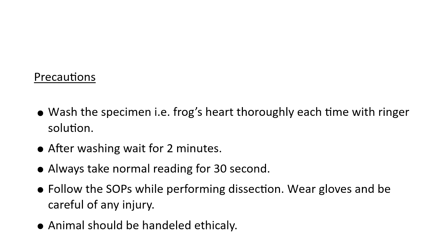Wash the specimen, that is frog's heart, thoroughly, each time with ringer solution. After washing, wait for 2 minutes. Always take normal reading for 30 seconds. Follow the SOPs while performing dissection. Wear gloves and be careful of any injury. An animal should be handled ethically.